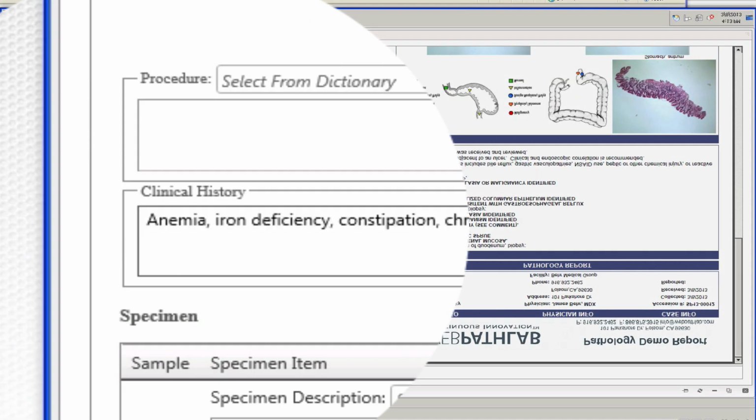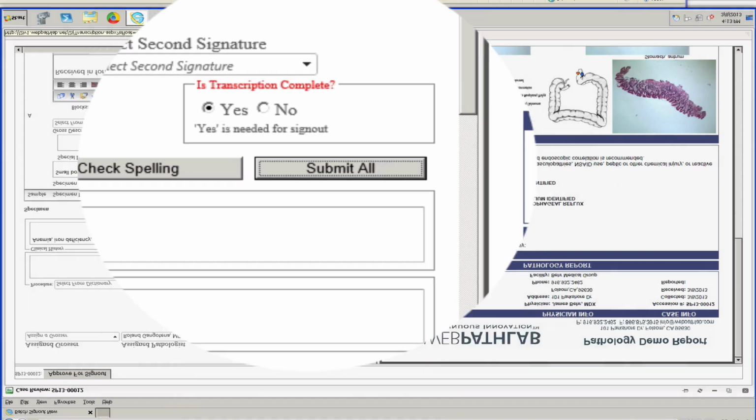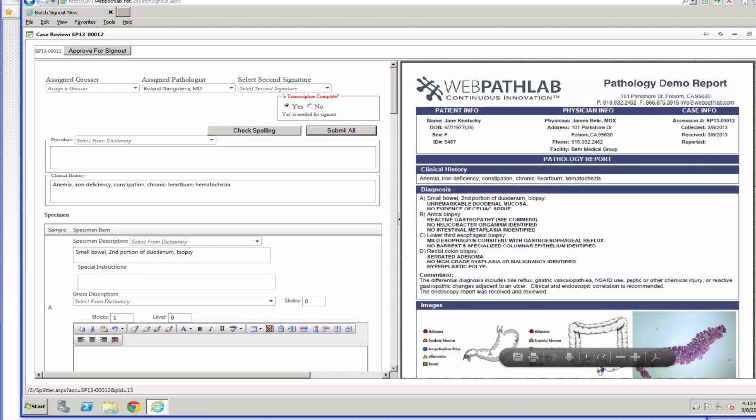All the other containers have been moved upwards, so there is no empty space on the report. To see the change in both directions, put the clinical history back in, submit, and the PDF again adjusts dynamically to include the new content.